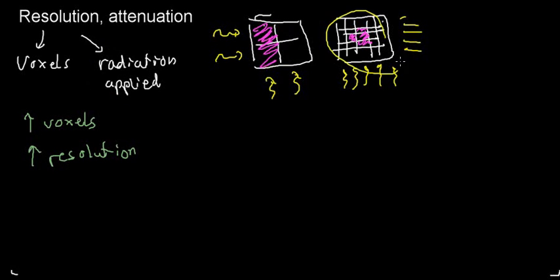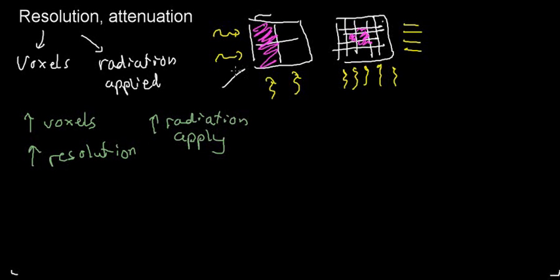So the more voxels I have, the more radiation I would have to apply. The more voxels, the more resolution, the more radiation I have to apply.